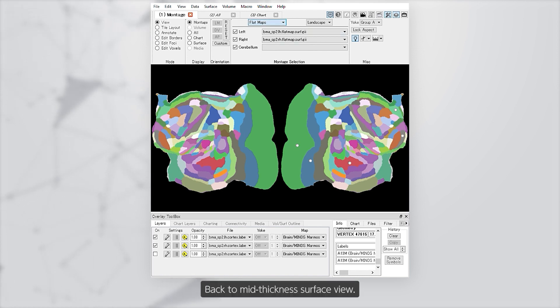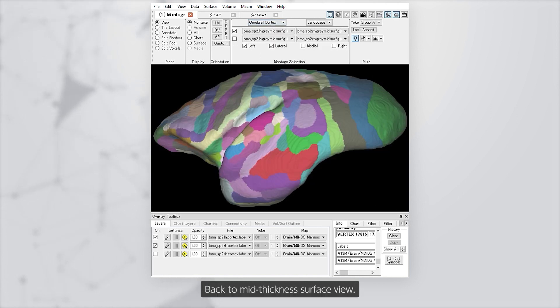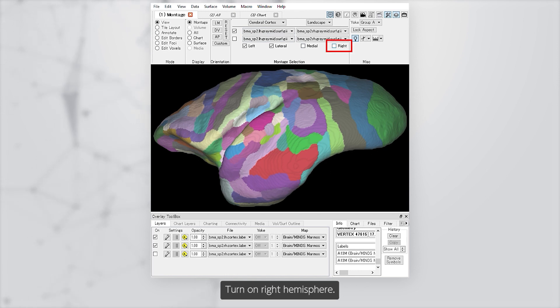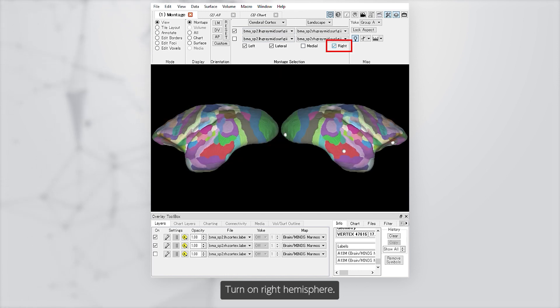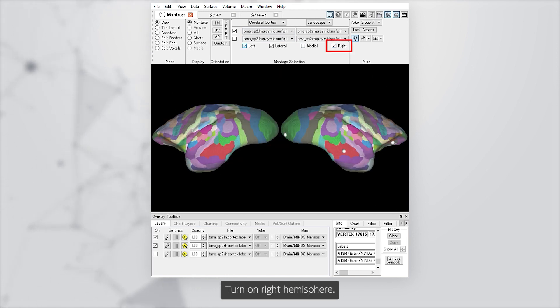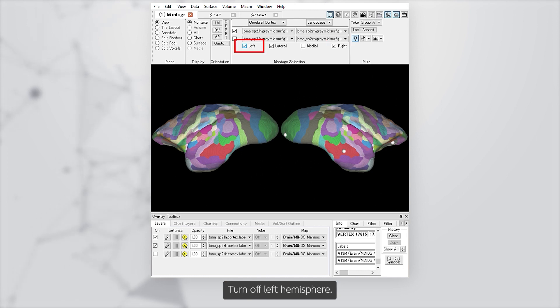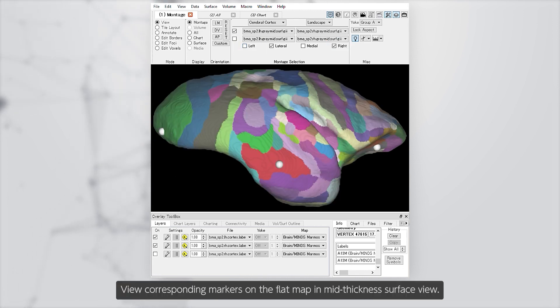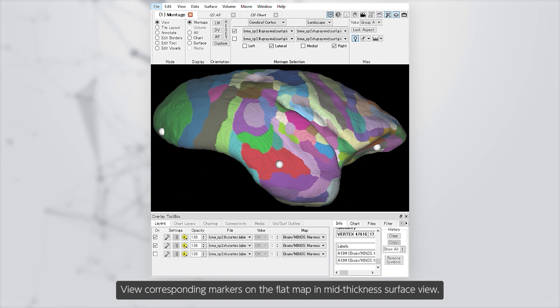Switch back to mid-thickness surface view. Turn on the right hemisphere and turn off the left hemisphere. View the corresponding markers on the flat map in the mid-thickness surface view.